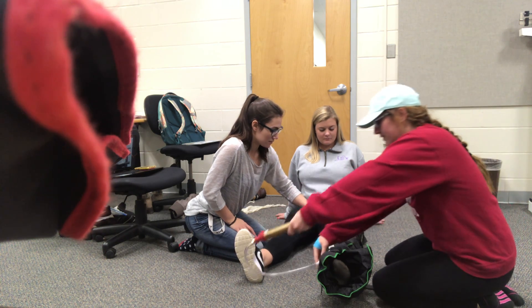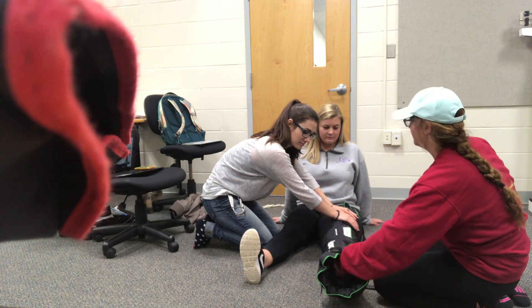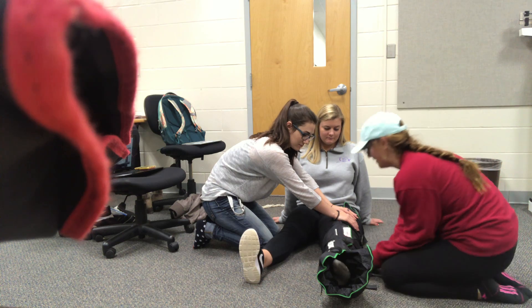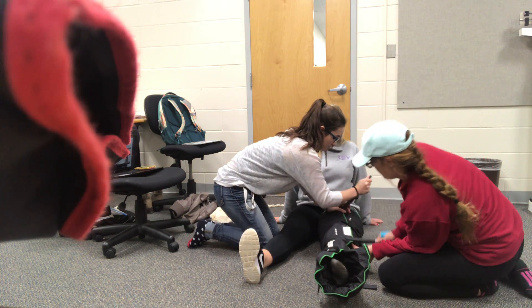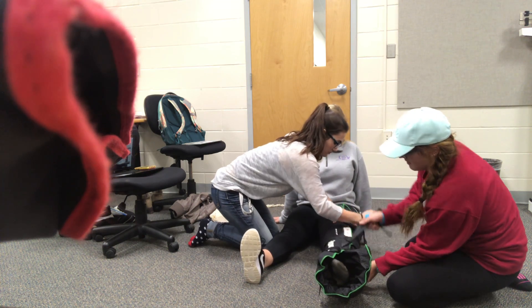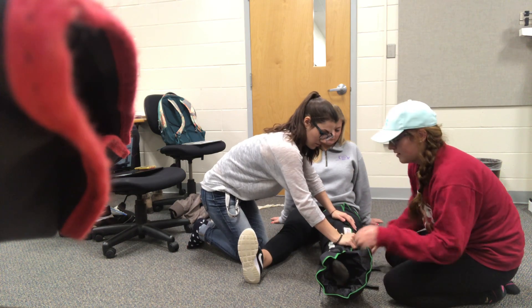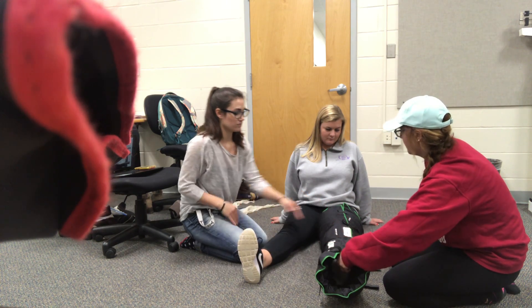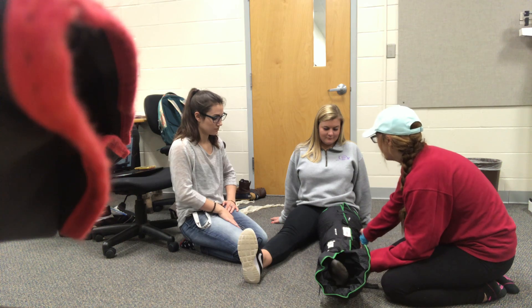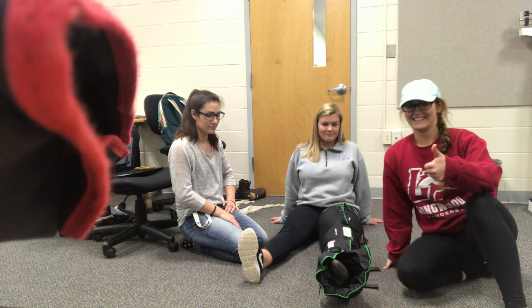All right, we're going to re-tighten the straps. First we're going to... Can you still pull this? Yes. Can you still pull your toes? Can you wiggle them? Mm-hmm. Can you even try to bend my knee? No. That's all great. Awesome. Good.